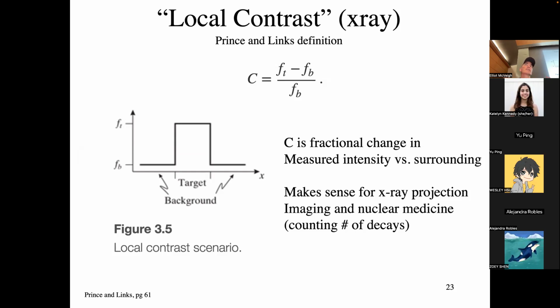And for something like this, oftentimes the spatial resolution isn't the biggest issue. It's can you resolve that, yeah, that is a definitive signal difference, and I have detected it and it's big enough to make me concerned. Spatial resolution is way down here. You're not going to call it if it's 3 pixels. You're not going to do that, right? Certain things like in your coronaries, you might start worrying about it, but for mets in the liver, you're not going to call it. So you have a different problem: is the signal difference the right signal difference for a tumor?